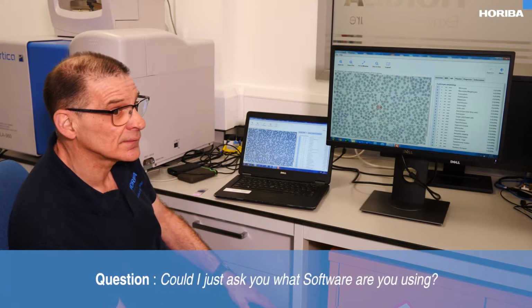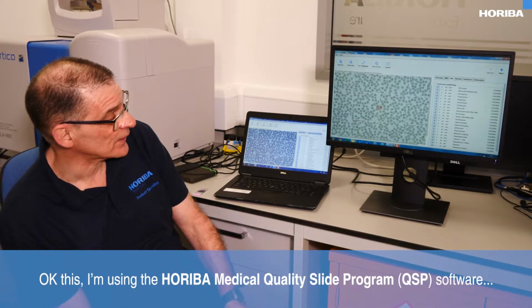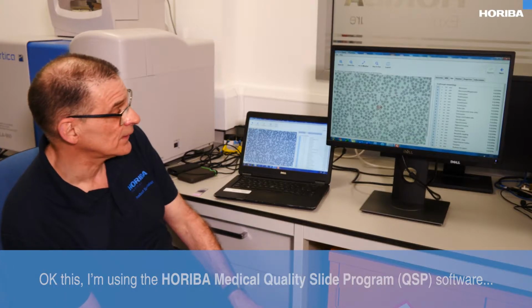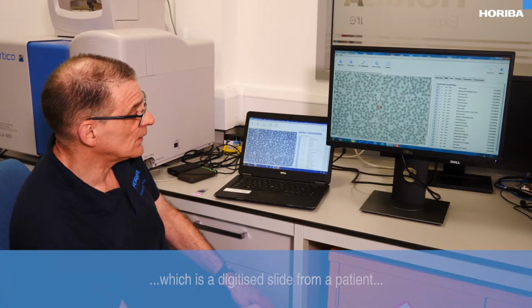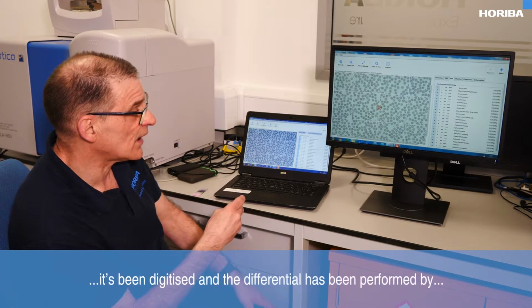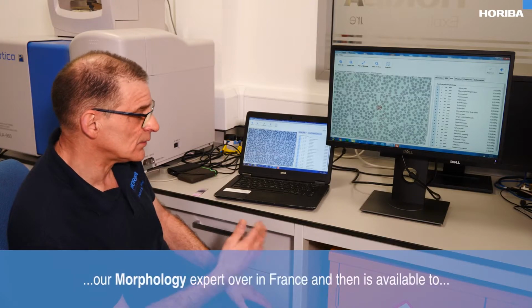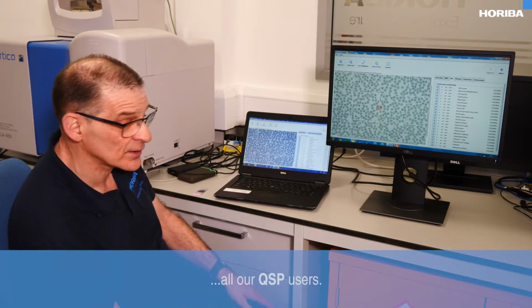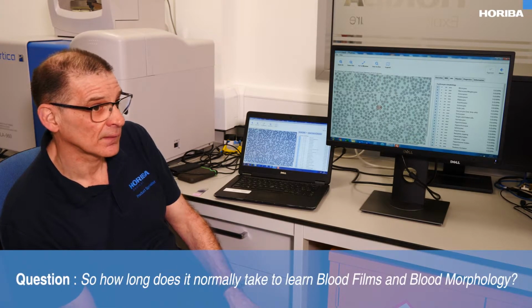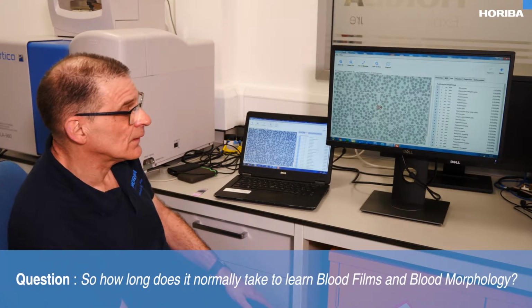Andy, can I just ask you, what software are you using? I'm using the HORIBA Medical Quality Slide Program software, which is a digitised slide from a patient, and it's been digitised, and the differential is being performed by our morphology expert over in France, and then is available to all our QSP users. So how long does it normally take to learn blood films and blood morphology?